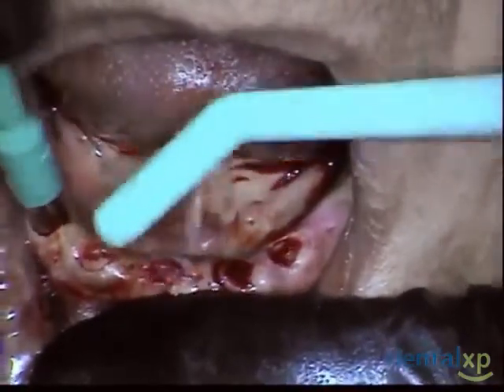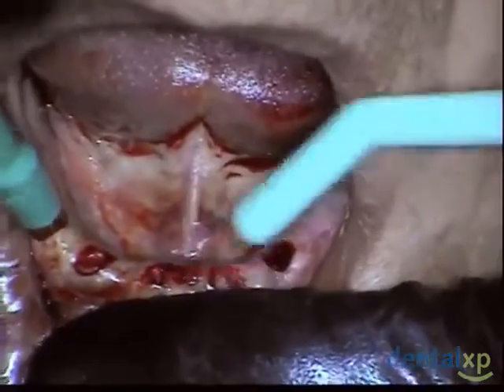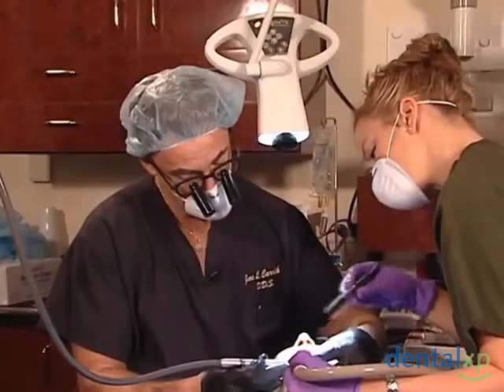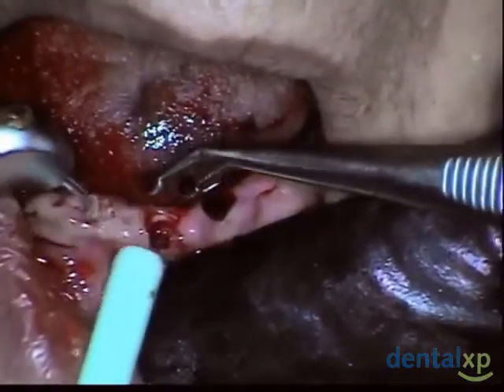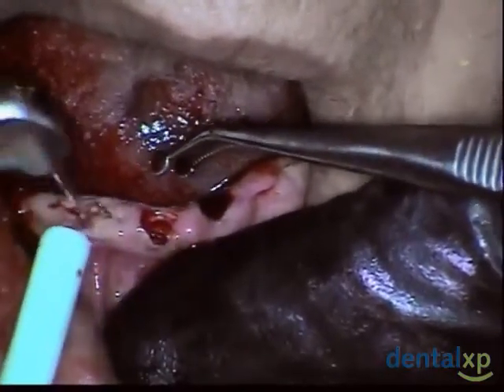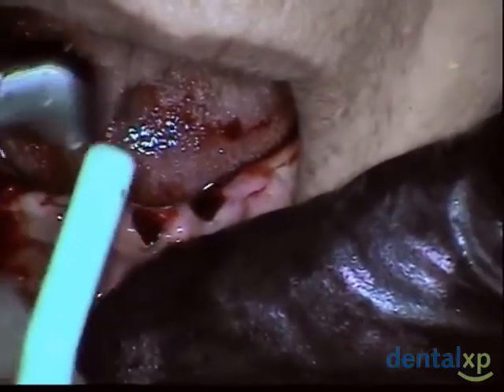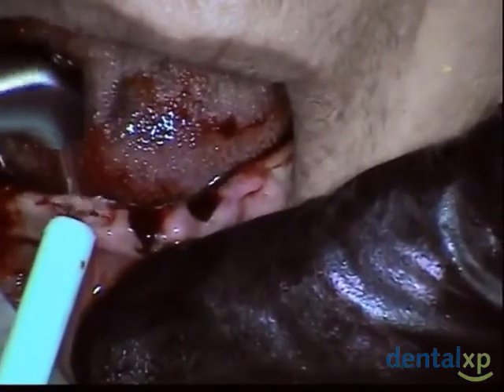However, if we don't need to, then it's easier on the patient and fewer post-operative visits. When you're having to make or place a flap or crestal incision and reflect the tissue, in many cases you'll find that it's extremely bound to the bone, and you need to be very careful reflecting your flap, or you'll tear the tissue, and then that just makes more of a challenge when you start to suture the patient back.